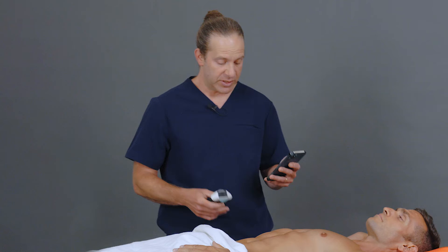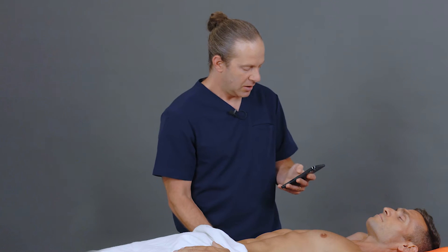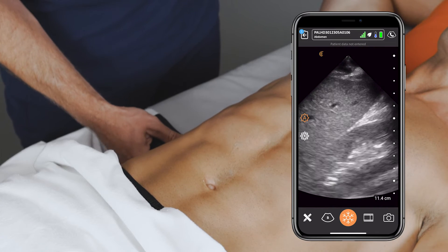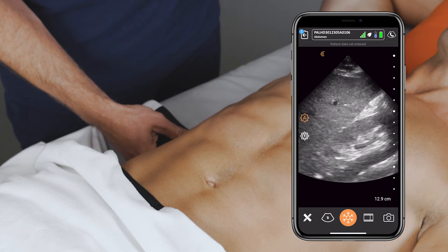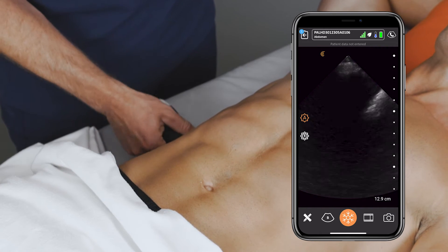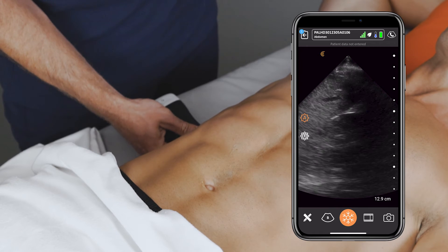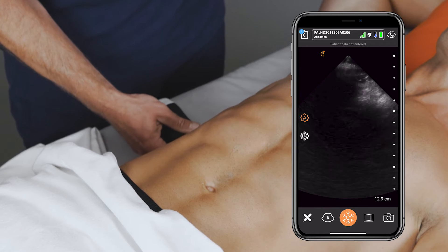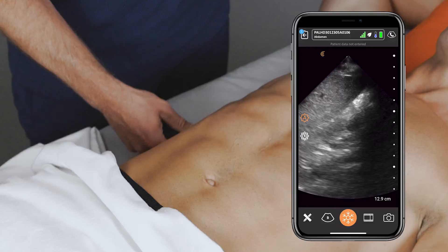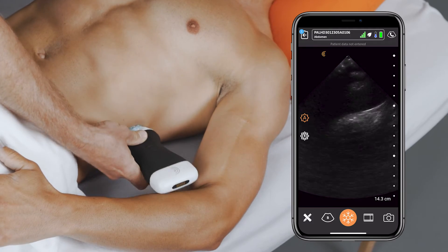Another common cause of flank pain to assess is the kidneys. Here I'll come to the right flank, and I'm looking for any signs of moderate to severe hydronephrosis that might be identified. If it's the left flank that's the issue, I'll swing and start there.